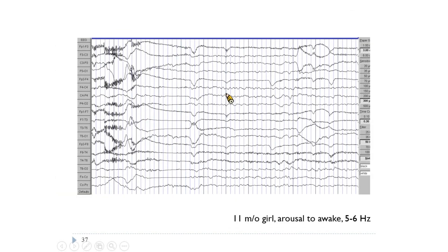These are the epileptic abnormal discharges seen under intermittent photic stimulation. There also appears to be a driving response at 7 Hz, though this is uncertain. This EEG from an 11-month-old boy shows arousal to wakefulness with a PDR of 5 to 6 Hz.